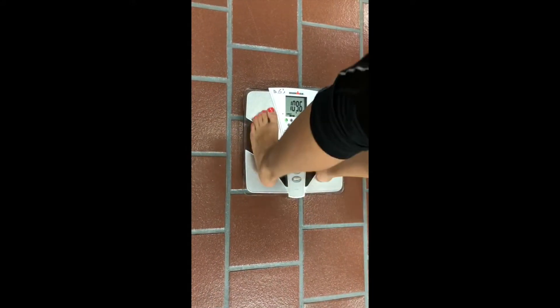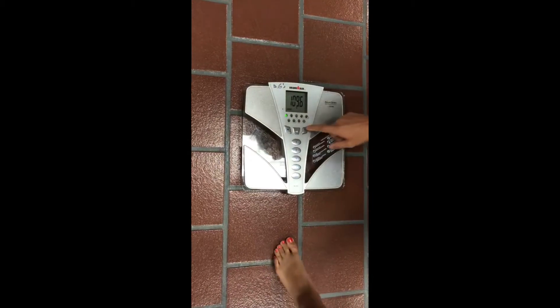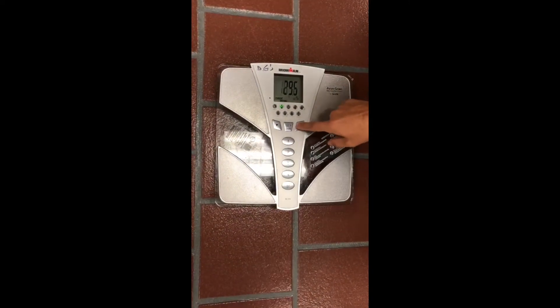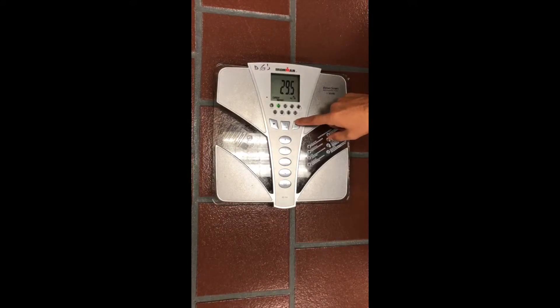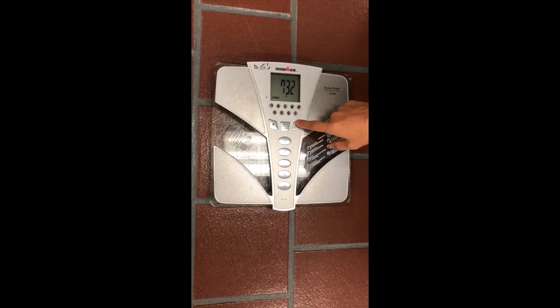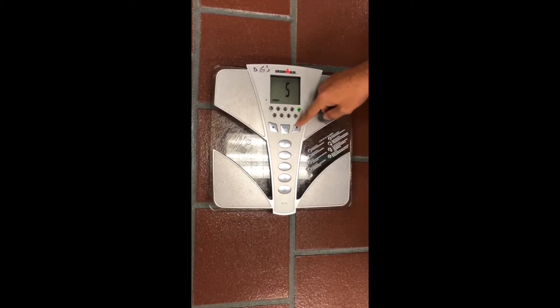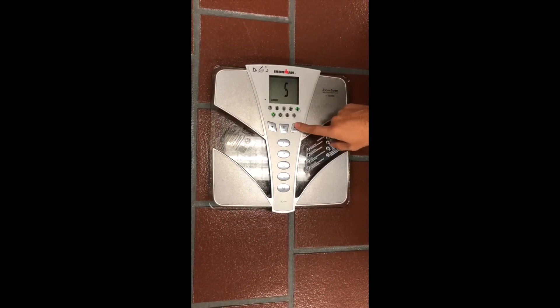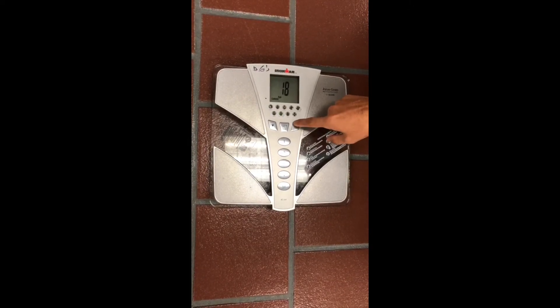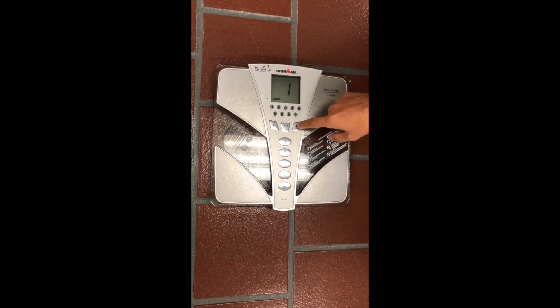Once measurements have been calculated, ask the patient to step off the scale. Readings for body fat, water percentage, muscle weight, physique rating, BMI, metabolic age, bone mass, and visceral fat are all calculated and displayed on screen.